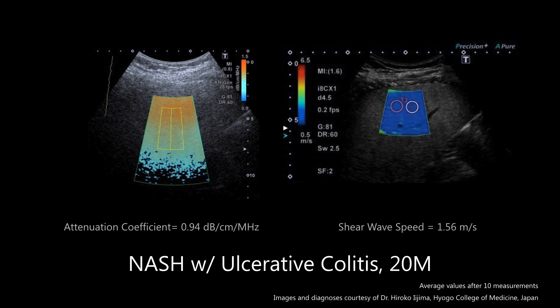This patient is at risk for further disease progression due to the effects of inflammation and fibrosis. As this example shows, attenuation imaging and shear wave elastography can provide complementary quantitative information to help increase diagnostic confidence.